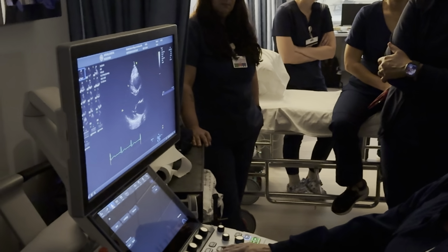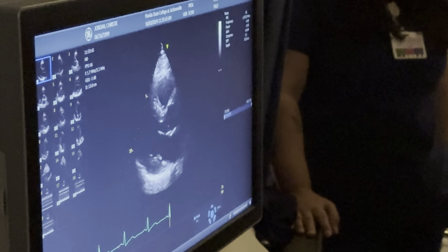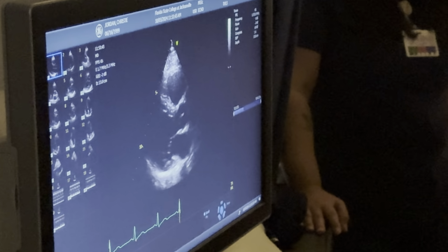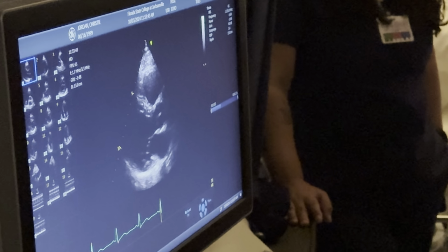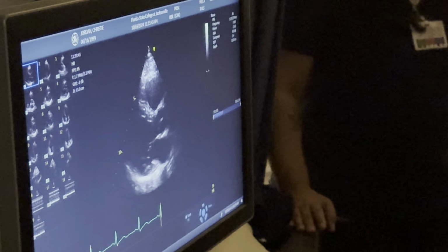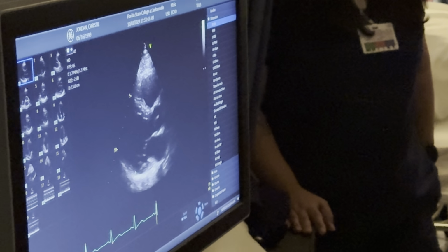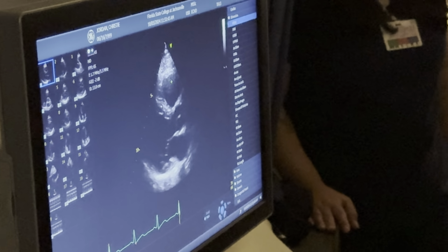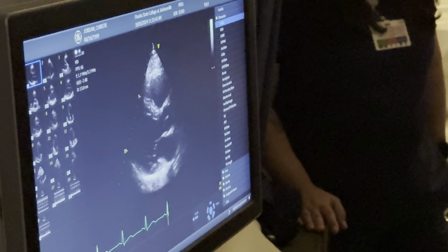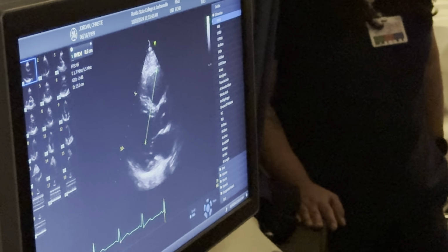All right, so pay attention to your mitral valve. Rapid filling, slow filling, atrial kick, and boom. Mitral valve is closed, aortic valve is closed. Measure. I'm going to kind of draw this line here. That's how I want to measure it, is right there.